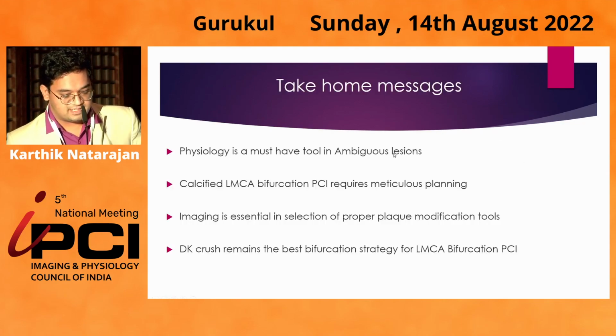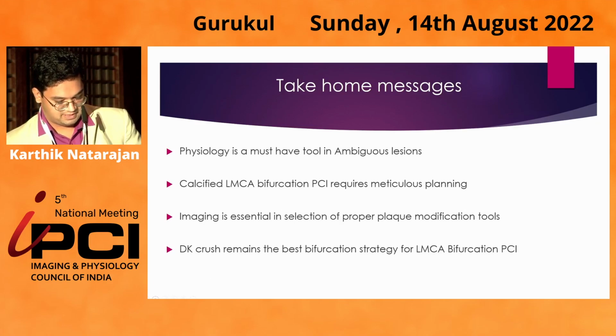So the take-home message is that physiology is a must-have tool in ambiguous lesions. Calcified left main bifurcation requires meticulous planning. Imaging is essential, and selection of proper plaque modification tools and DK crush remains the best bifurcation strategy for a left main bifurcation PCI. Thank you.